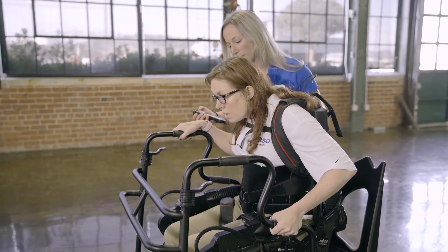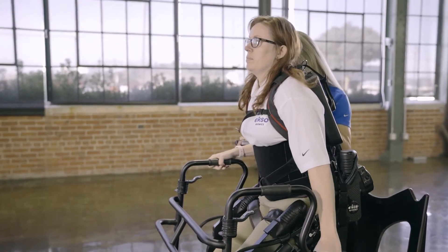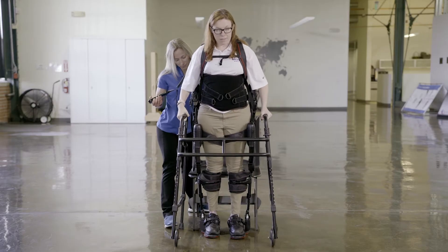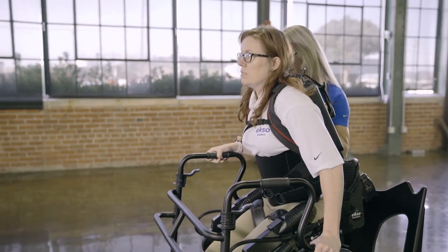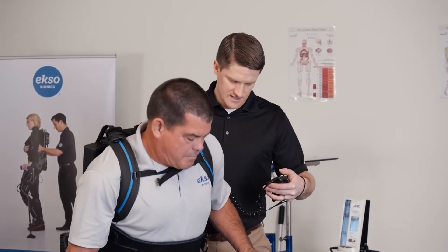XO will sit the patient up to 90 degrees, then lean forward. At the end of the lean, the patient must push up on the assistive device and assist with getting their weight balanced over their feet. The transition is assisted by the PT for balance purposes. There is a second way to stand that doesn't require the patient to lean as far forward.